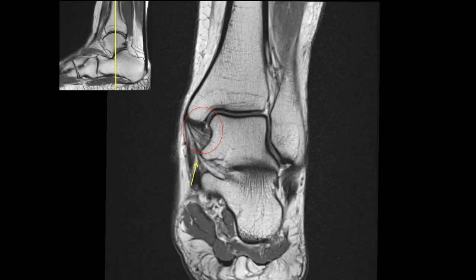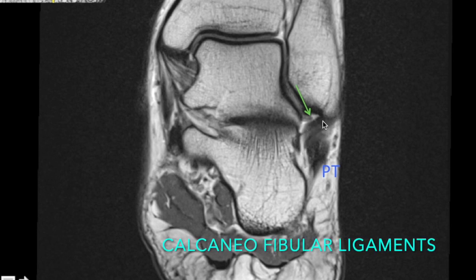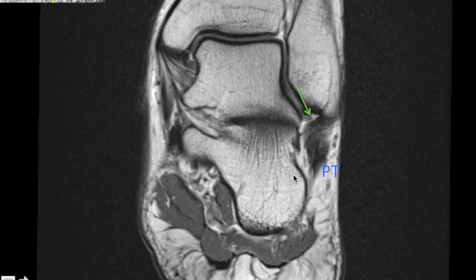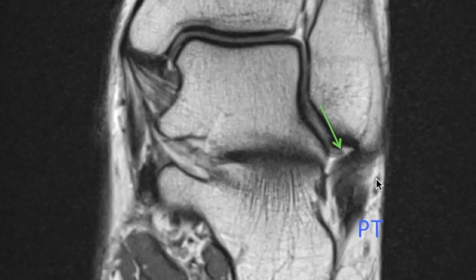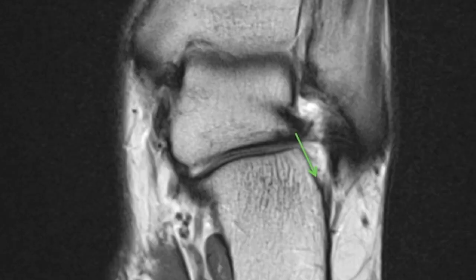On the coronal images we look at the calcaneofibular ligament, which is thick towards the fibular attachment and becomes thin towards the calcaneal attachment. This ligament is present deep to the peroneal tendons. It is an oblique ligament, so as you go posteriorly you can see it goes towards the calcaneum and has a thin attachment there.